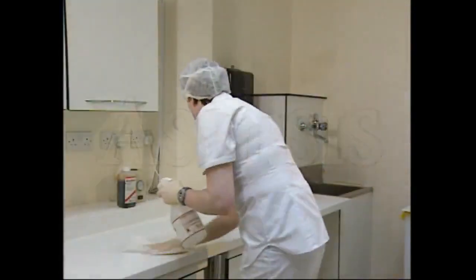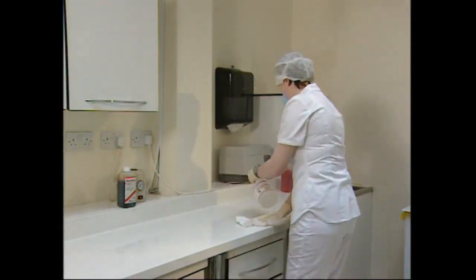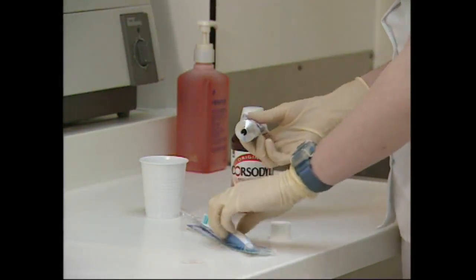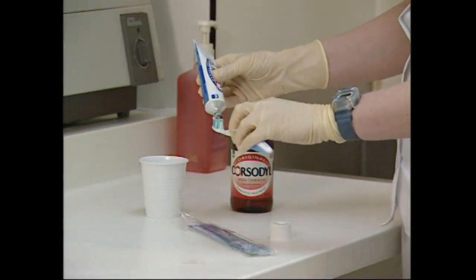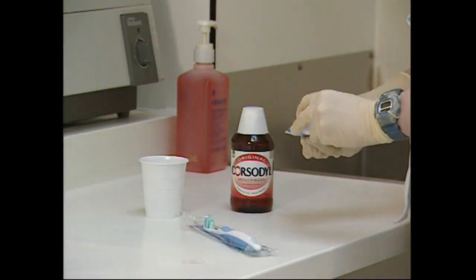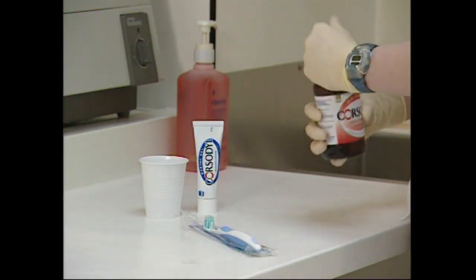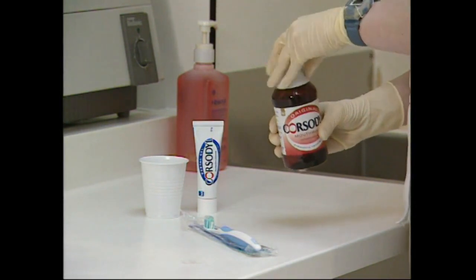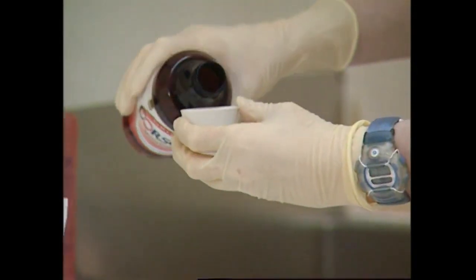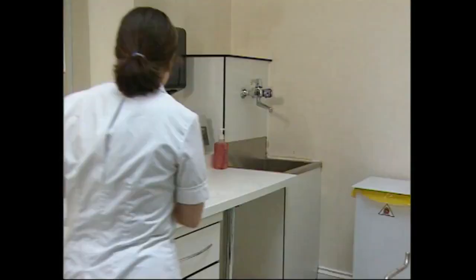The work surfaces are cleaned using a proprietary disinfectant and wiped thoroughly. The patient is prepared by requesting that they clean their teeth by brushing thoroughly using a chlorhexidine gel for two minutes, followed by a rinse with a chlorhexidine mouthwash for a further two minutes. Prior to surgery the patient will have seen a hygienist to ensure that the mouth is healthy and free from inflammation.